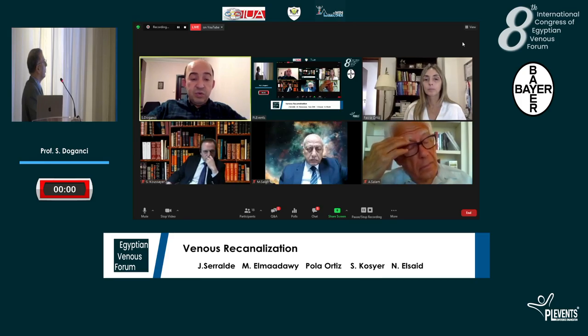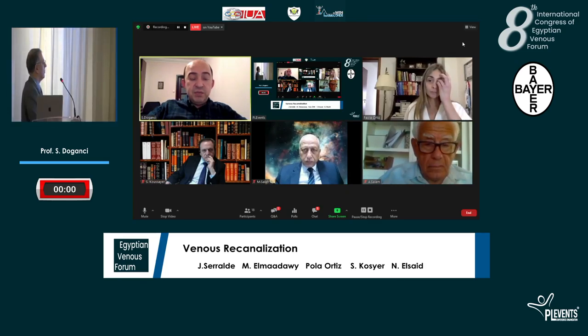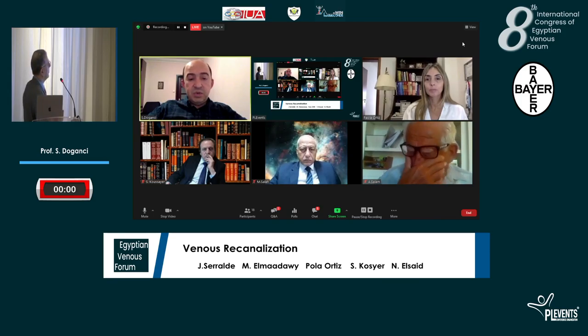But if you go too far, in the long term, especially after 2 years, when the pseudointima covers the inside of the stent, you can have a contralateral deep vein thrombosis. When you look at Dr. Raju's data, there is a 10% contralateral deep vein thrombosis with the wall stent. Then they changed their practice and are now making the Z-stent configuration, an open cell design with high radial force. After the Z-stent configuration, their contralateral DVT incidence decreased to 1%, but this is a very important issue.